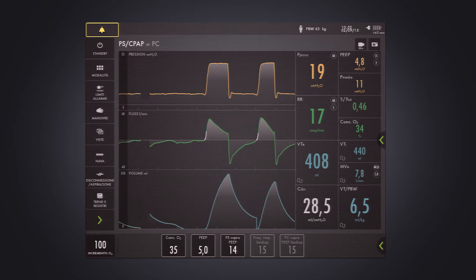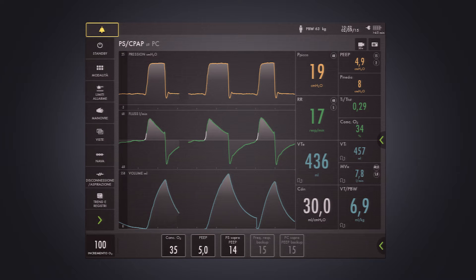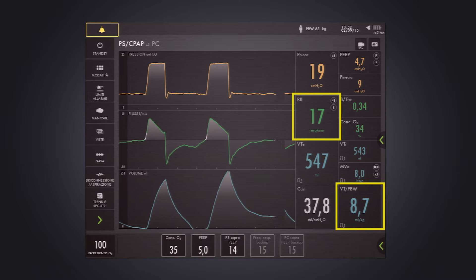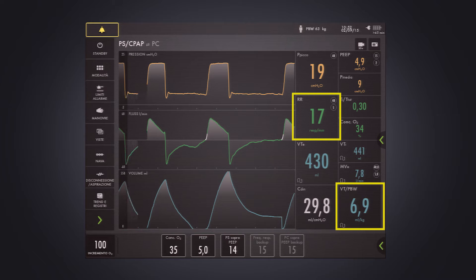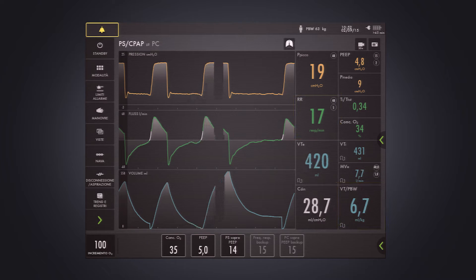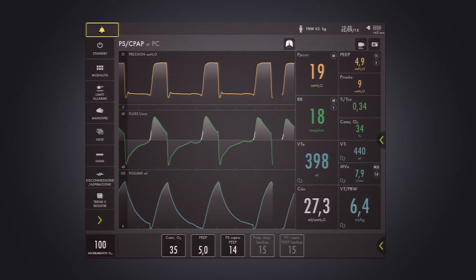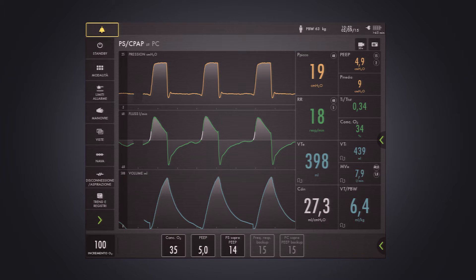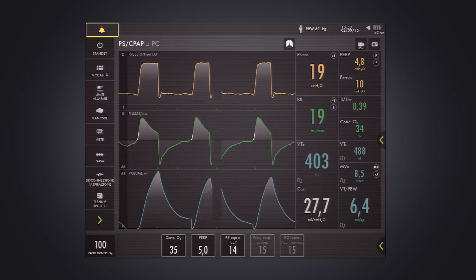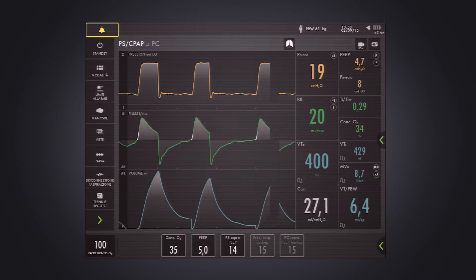I can talk about adequacy of ventilation because of respiratory rate and tidal volume, and because I can't see any ineffective effort or any major asynchrony on the flow curve. But I think I need something more — and that something more is the EDI signal. So let's see what happens when we display an EDI signal on the ventilator through an EDI catheter.